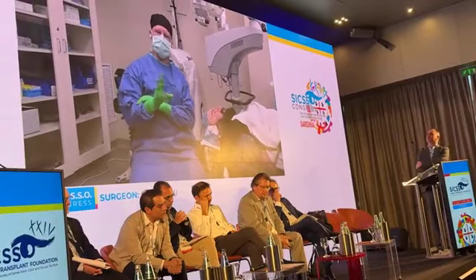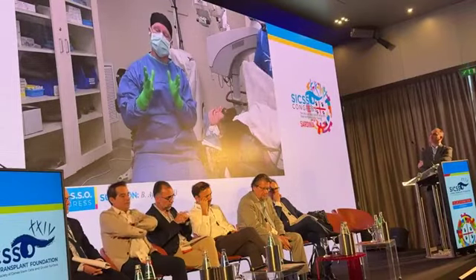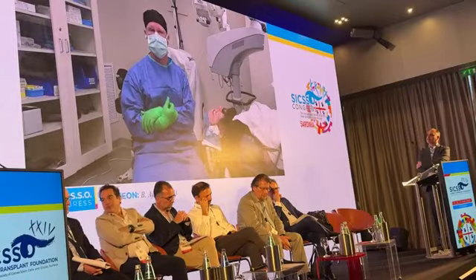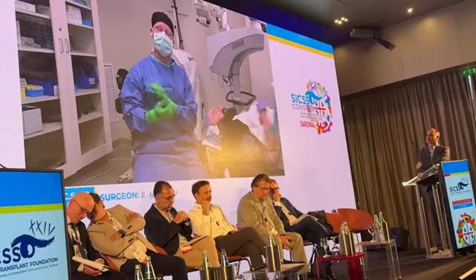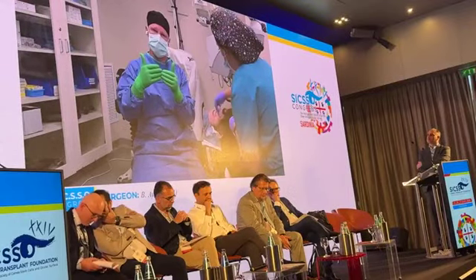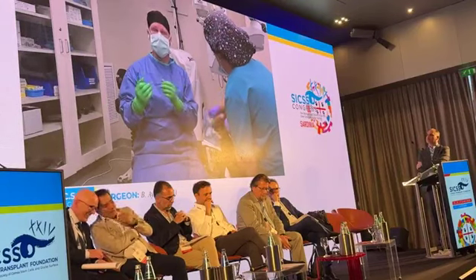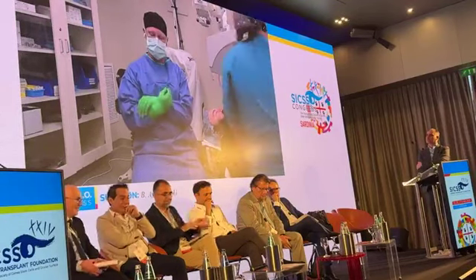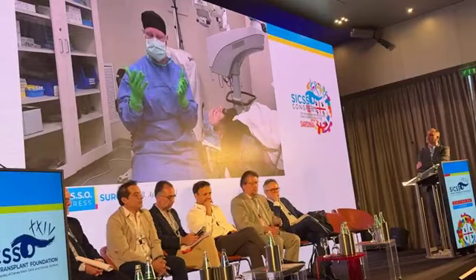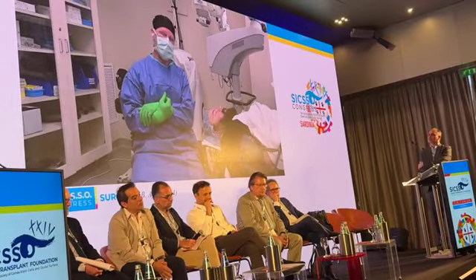So there's three components to the marking. One of them is the axis of incision. And so I actually mark the axis using what's called a robo marker, but it's basically as if you were marking for a toric IOL in pre-op. So for him, that was 150 degrees. And that helps you align where the incision into the cornea is, or the entry incision for the CTAC. Now, on the surgical plan, there will be a map where you measure from the pupil center, and the instructions are all given to you by the nomogram from CorneaGen for CTAC.